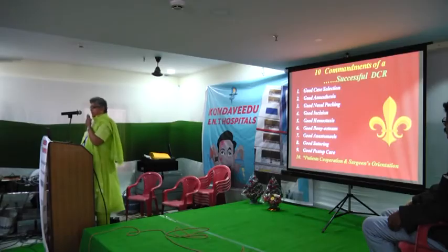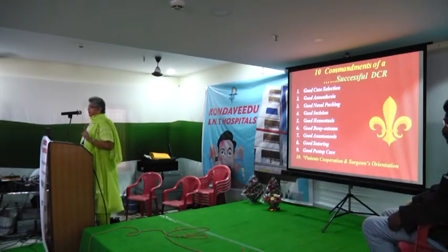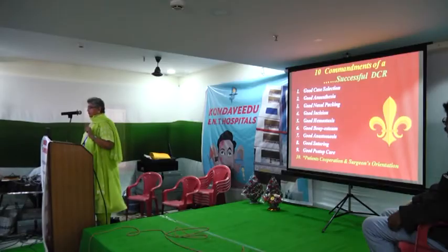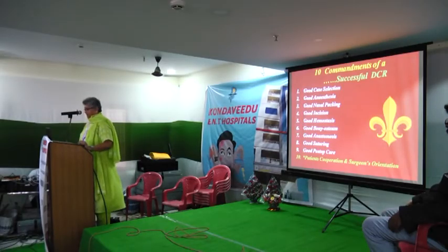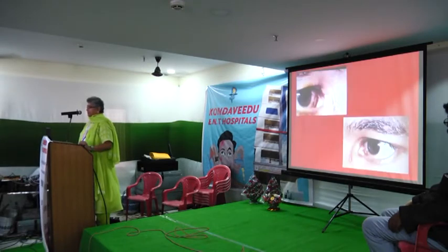So coming to the final point, how to make a successful DCR: good case selection, good anesthesia, good nasal packing, good incision, good hemostasis, good bony osteum, good anastomosis, good suturing, good postoperative care. Finally, patient cooperation and the surgeon's anatomical and surgical orientation are very important. See, that is the postoperative picture, that is the scar.